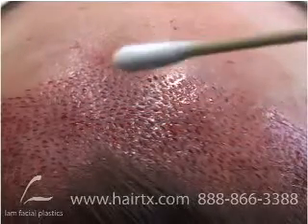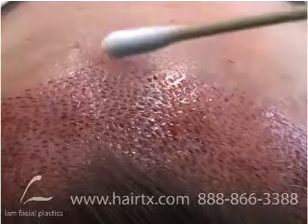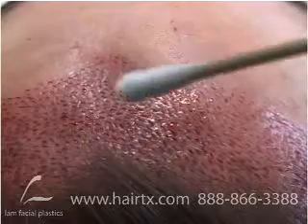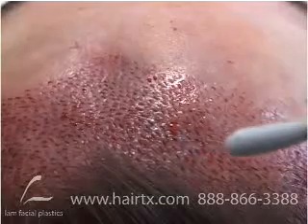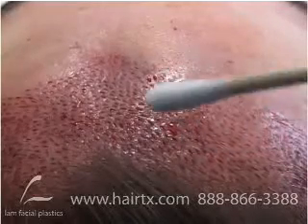And then as you go forward again, we then recreate the cowlick going back in the last half a centimeter to a centimeter going backwards. Those three different angles are very important, so that you don't make any abrupt transitions. Everything is very soft and gentle as that transition goes forward. And then as you see going this way, the angles start to turn back anteriorly. We'll get a better view of that as we move over to the right side.